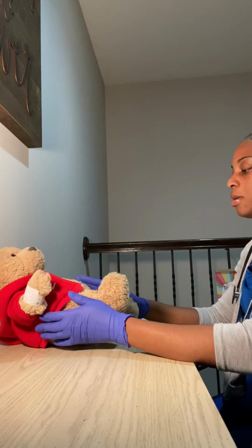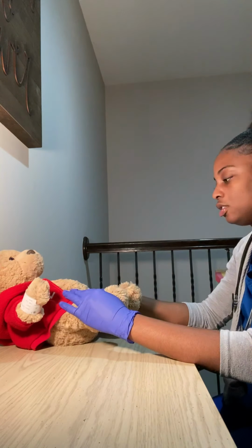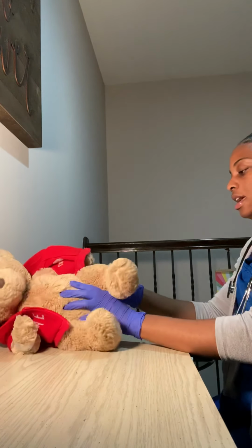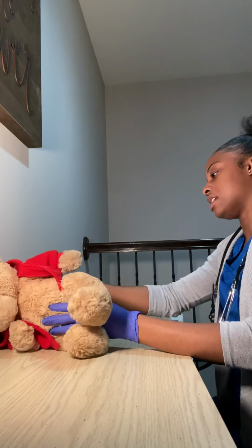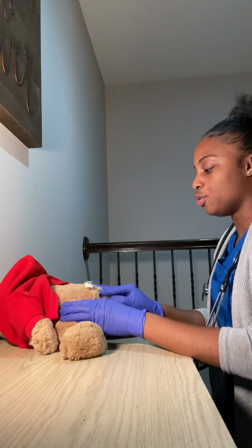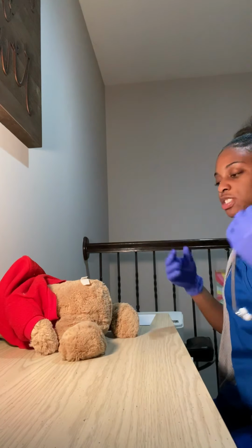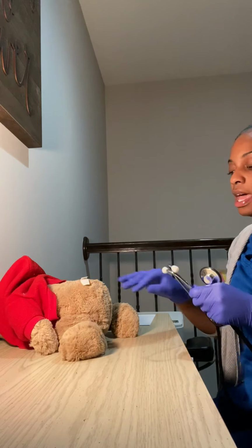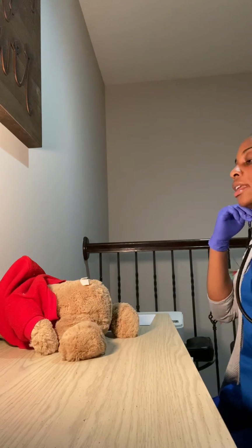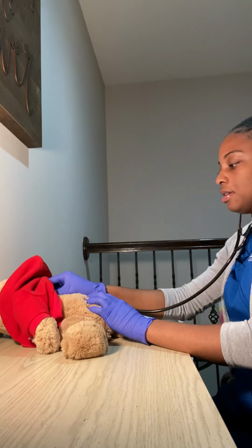Okay, so then I can turn my patient on her side so that I can take a better look at her posteriorly, and I can listen to her lung sounds back there as well. So we're gonna go ahead and do that, and I'm still assessing the skin. There's no signs of any skin breakdown, no lesions. Her butt looks good. There's no wounds, no decubiti on her coccyx, which is great. Because she's bedridden, in cases like this, I can go ahead and decide to put some barrier cream on there to prevent any breakdowns.